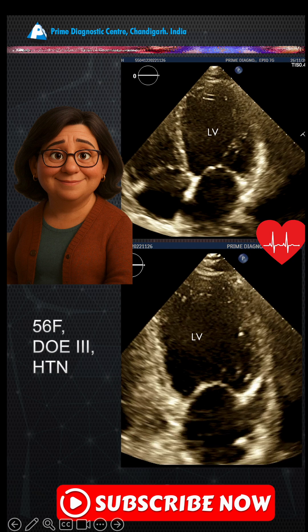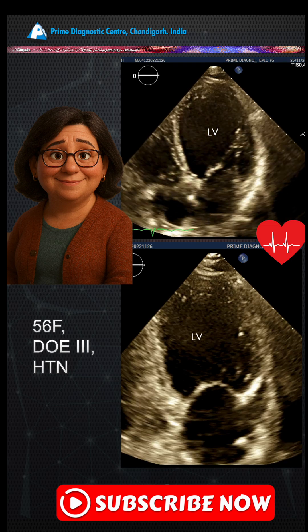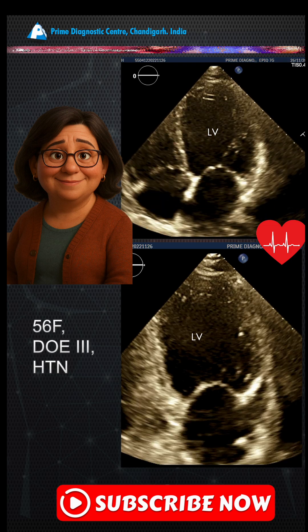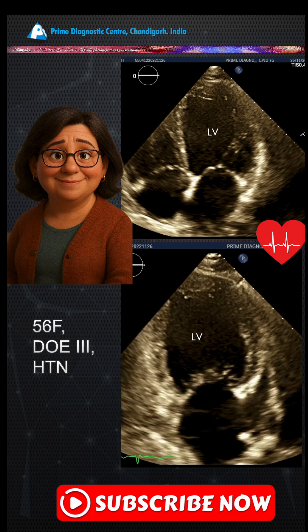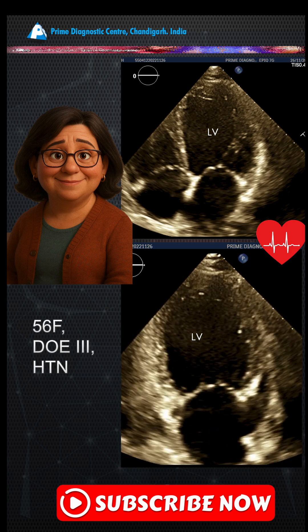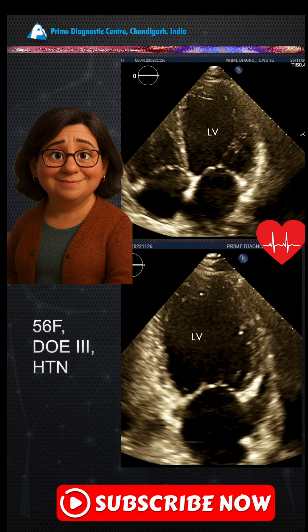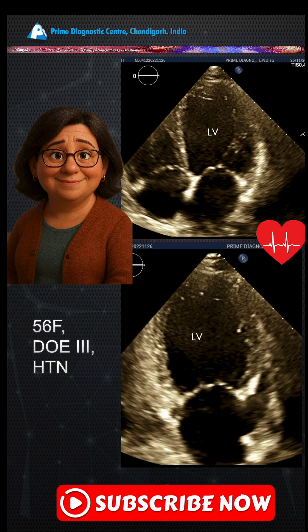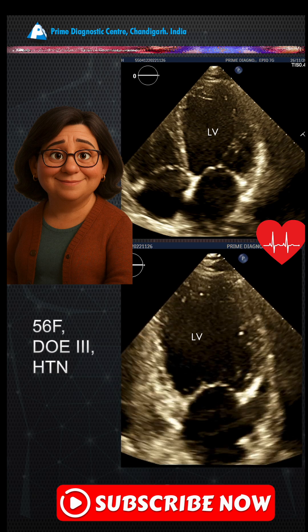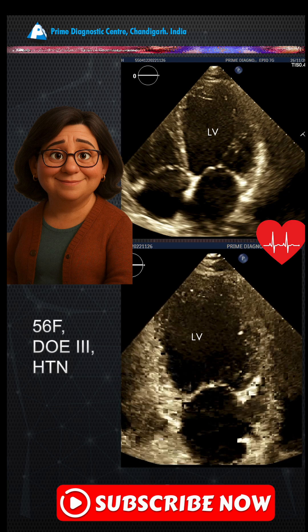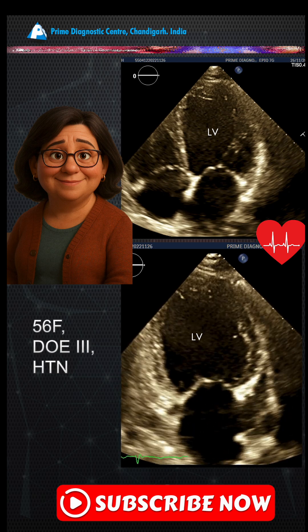Presenting a 56-year-old female who presents with dyspnea class 3 and is hypertensive. On an echocardiogram 4-chamber view, you see a dilated and hypokinetic LV. On the 2-chamber view, you see the LA and LV dilated with a hypokinetic LV, with an ejection fraction of around 28 to 30 percent.